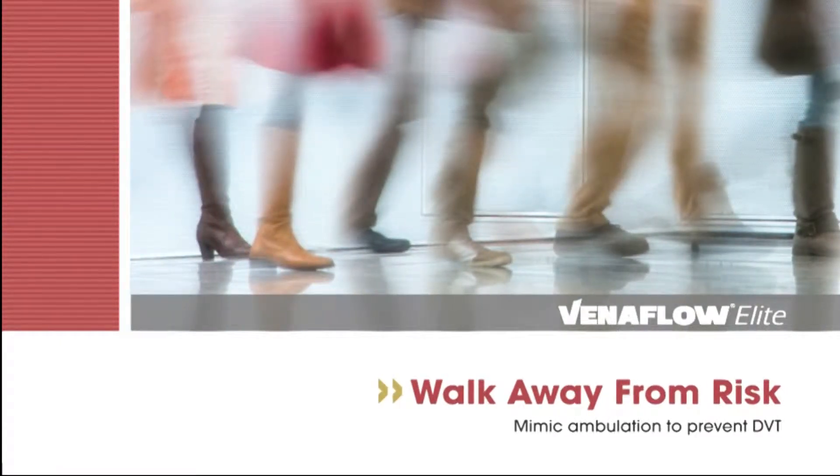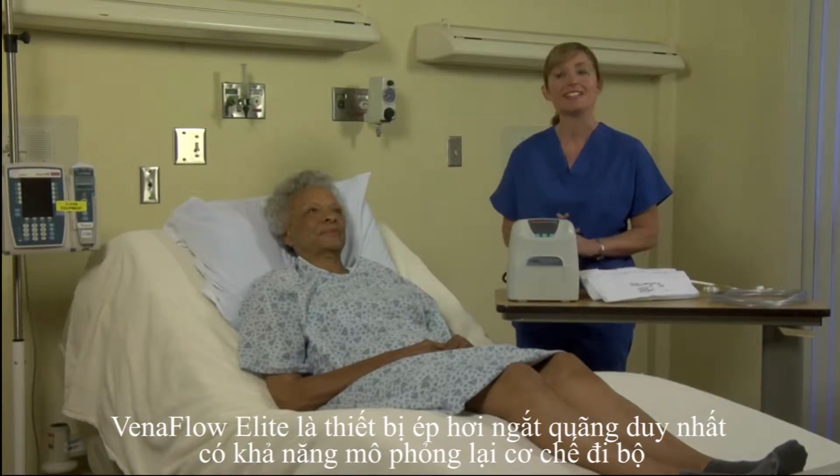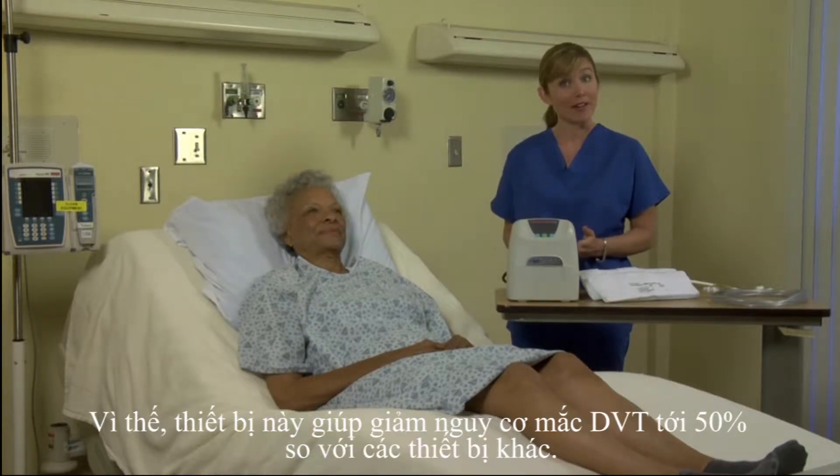Walk away from risk with Venaflow. Venaflow Elite is the only DVT compression device that mimics ambulation, and consequently it's proven to reduce DVT rates by 50% versus other devices.